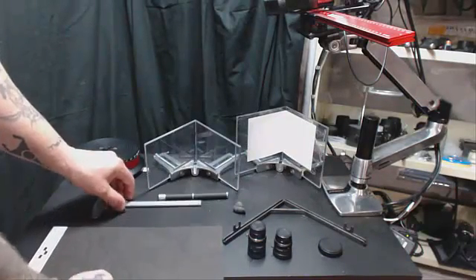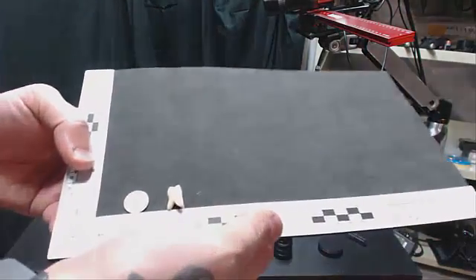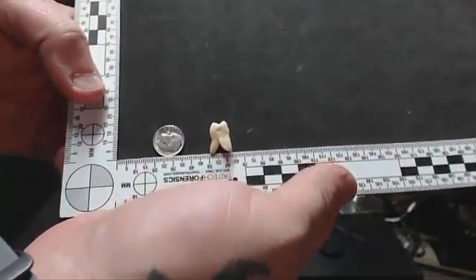Let me show you what we're going to be imaging today. This is the tooth I was referring to, positioned so the camera can have a chance to focus on it.